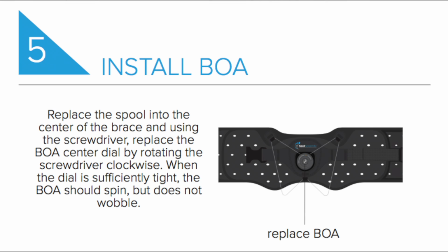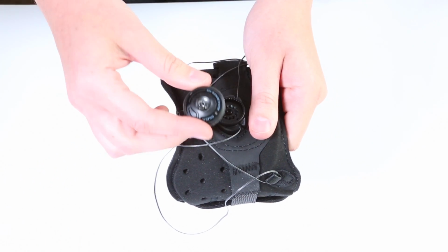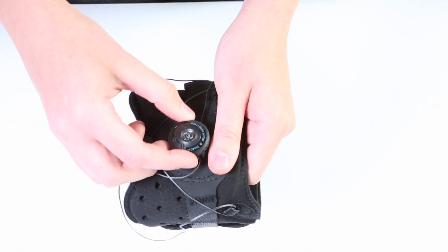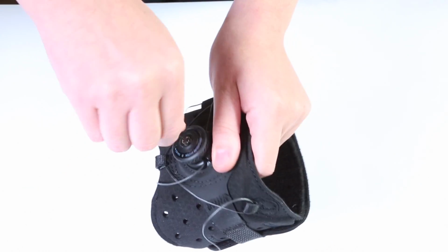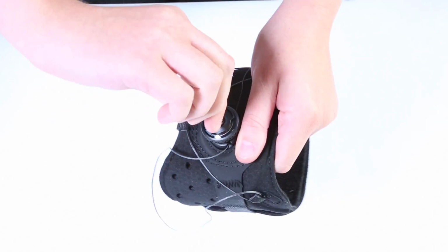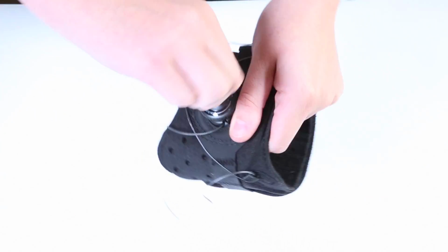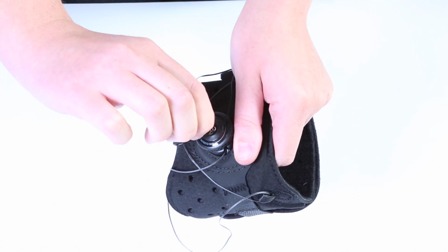Now step 5. We're going to install the BOA dial back onto the brace. So I'm going to take my dial, put it back there in the center, and my screwdriver again, and tighten that up. Now we're going to do the brace just barely as tight as it can go. So now the brace is tight.